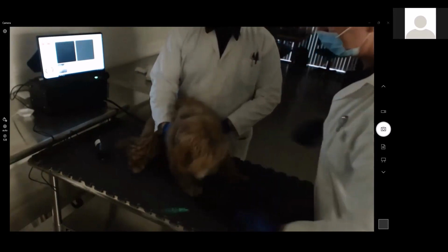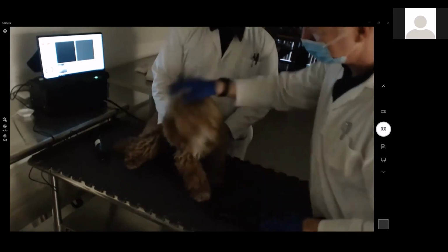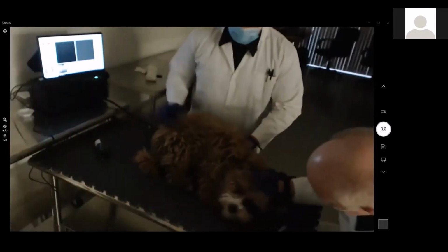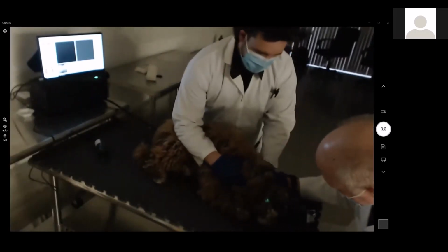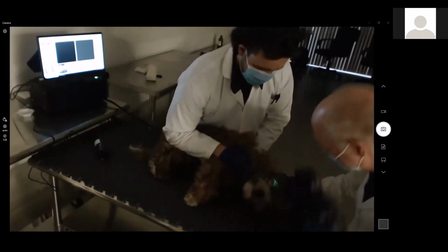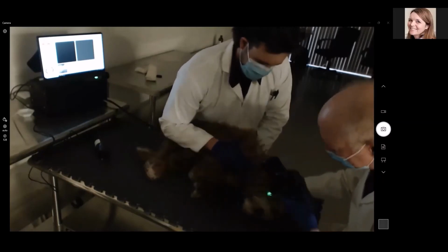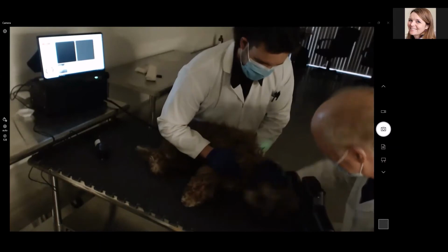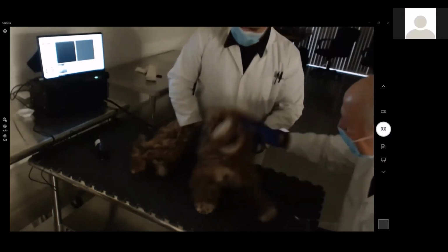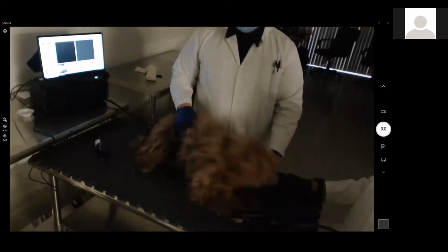Okay, we'll try one more time here. Good boy. Work with me here. Good boy. Let's see if we can get you laid down. Let's just try that. You're a little different, okay? Okay. He is just all over the place here. Oh, it's adorable, but not getting much done. Oh boy. Okay. Folks, I think I'm going to try to call it quits.